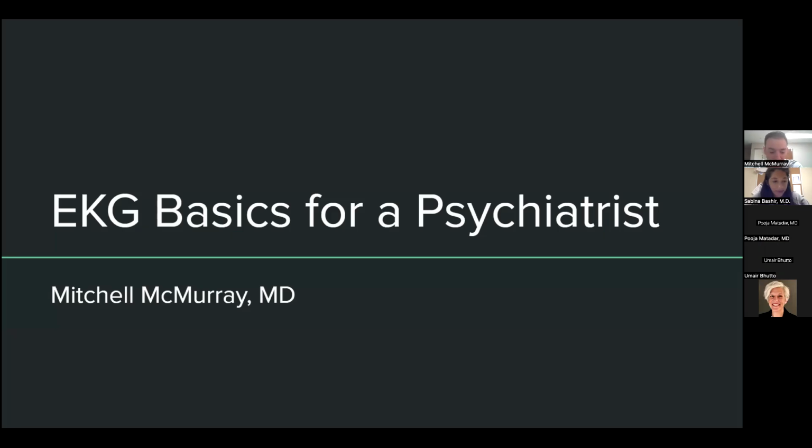We need to have an EKG lecture that's really basic for psychiatrists. So that's the name of this lecture. It's really meant for new second years or second years that are going to be in EPS and have some undifferentiated patients or patients that come over from the ED that need EKGs, or mention that they're having chest pain in EPS and you get handed an EKG.